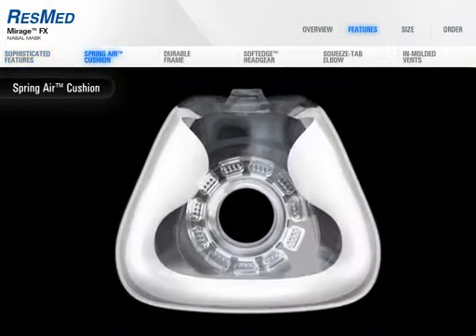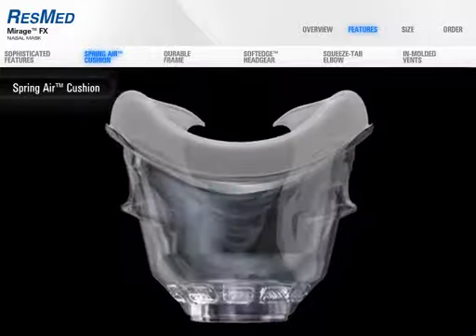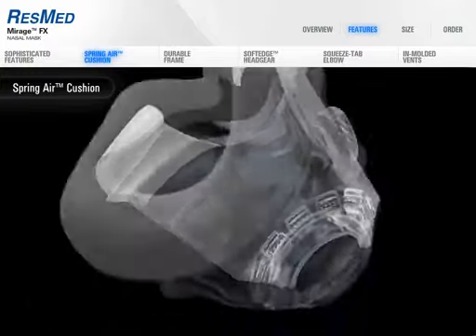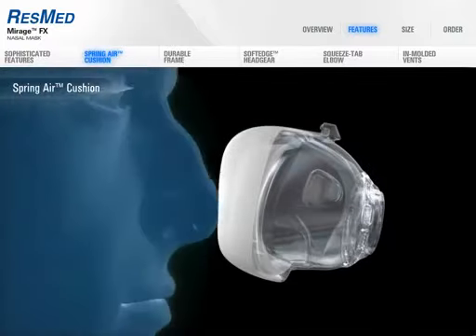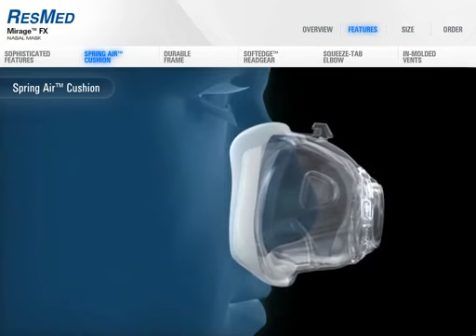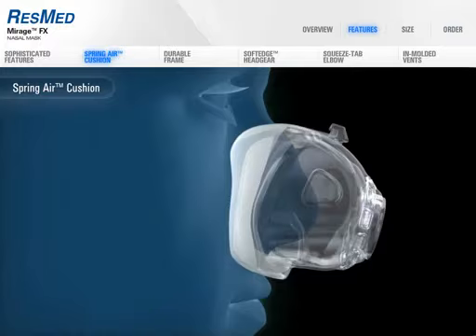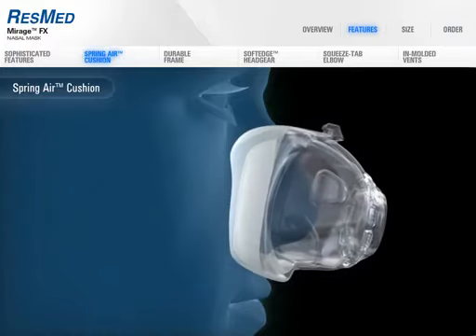Mirage FX is the first nasal mask to incorporate ResMed's unique spring air cushion. The inner wall is cut away at the nasal bridge to allow a softer texture in the outer wall, reducing soreness, irritation, and discomfort commonly felt in this sensitive area. The spring air cushion flexes gently against the face, maximizing seal and comfort without the need for over-tightening.